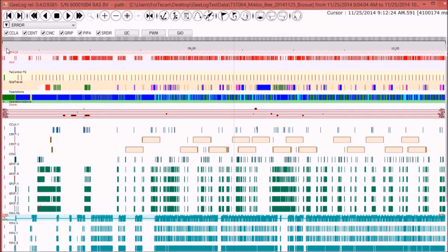In this case, we are talking about more or less 2 hours and something, from 8:00 AM up to 10:30 of the 25th November. And this can be seen in this top scale. These log files are more or less 150, and each of them is represented by one of these rectangles. Being each log file composed by 5 megabytes, you can easily imagine that we are talking about half a gigabyte worth of data.